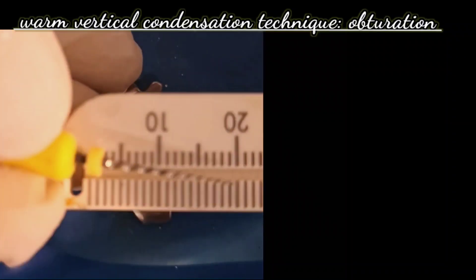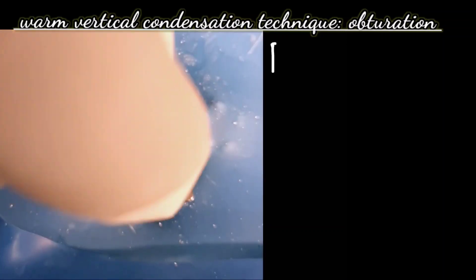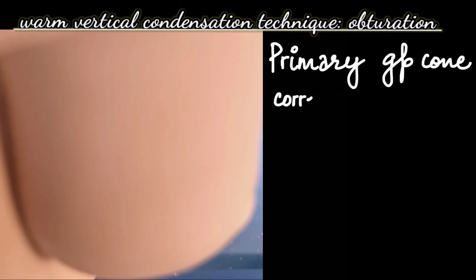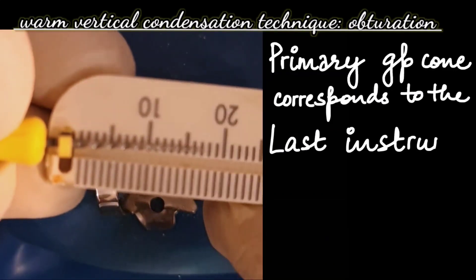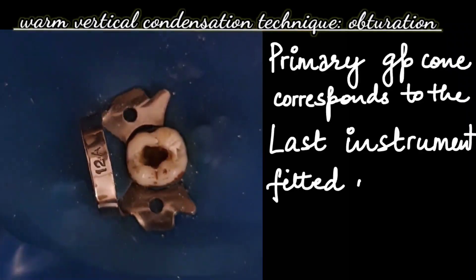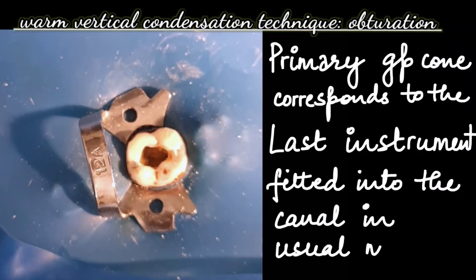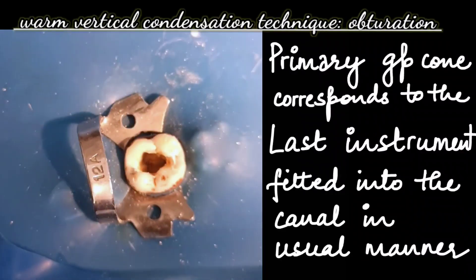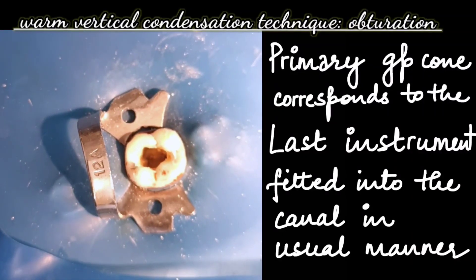We check all the canals with the last instrument, which is the master apical file. We confirm the working length in all the canals. Before beginning with the gutta-percha, we check with the master apical file fitted into the canal, and afterwards we proceed with the primary gutta-percha cone.